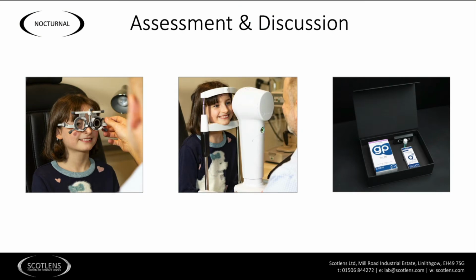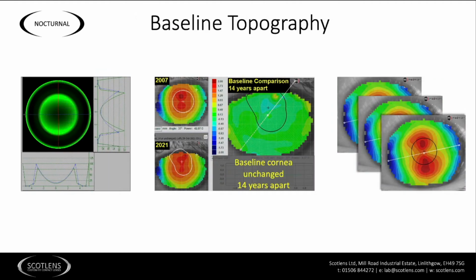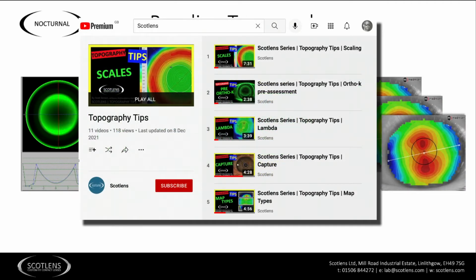In previous videos we've covered the refraction correction. In this video we're going to talk about assessment and topography assessment in order to get all the information you need to order your lenses. For more information on topography specifically, we have a video series called Topography Tips that takes you through various components of topography, so you can feel free to check that out.